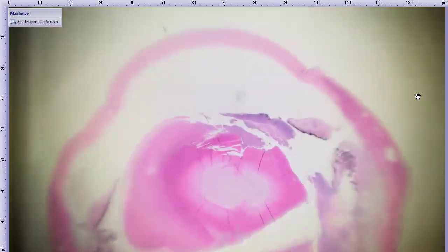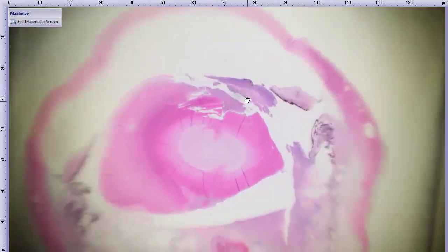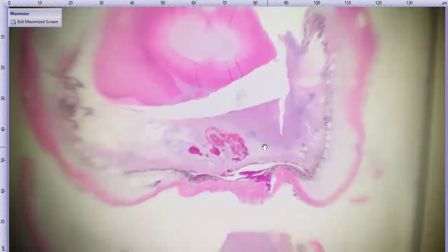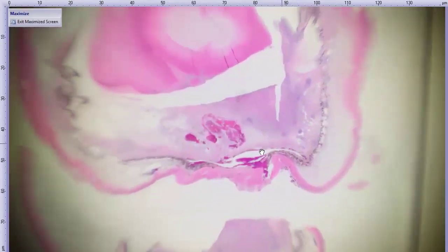Right. So cornea up at the top, looking pretty unremarkable. Here is our lens, which we can see again, looking a little choppy here. There's a lot of hypercellularity, purple stuff here that does travel around into the vitreous. We've got our choroid here expanded by some clear space.